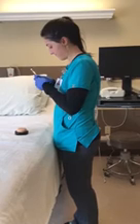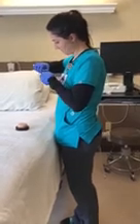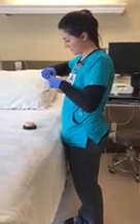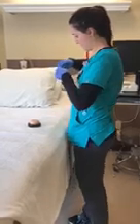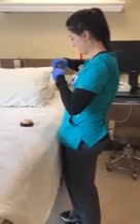Okay. It'll be just a second, Bob. This is a little stuck here. Yeah, that's been happening. They just don't make needles like they used to. In my day, they were made out of glass.